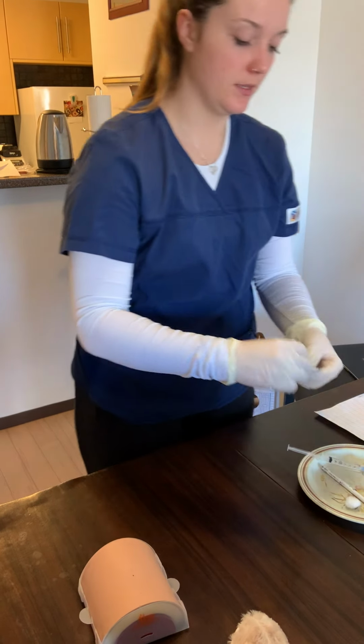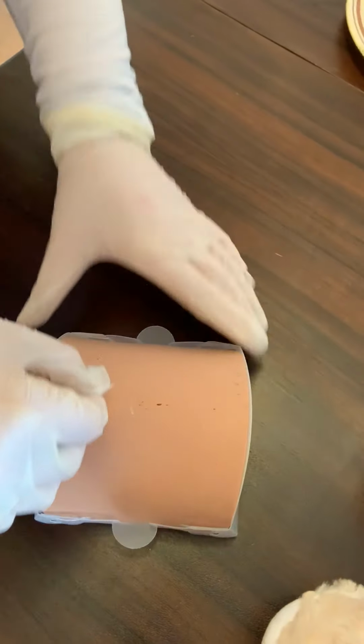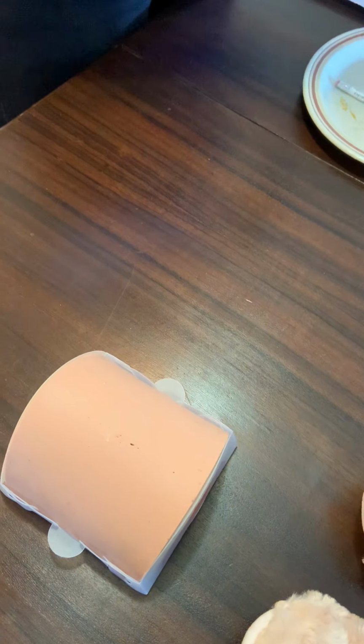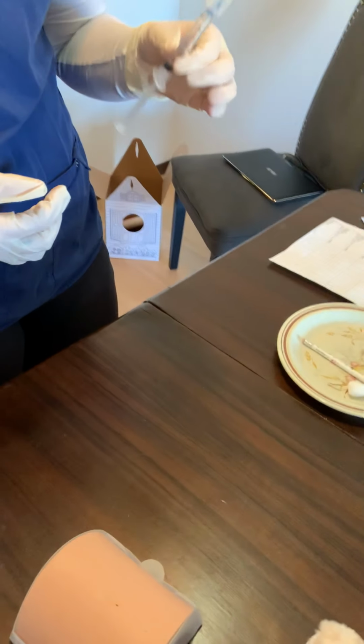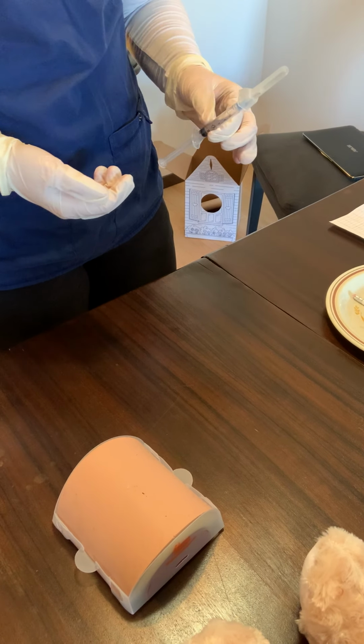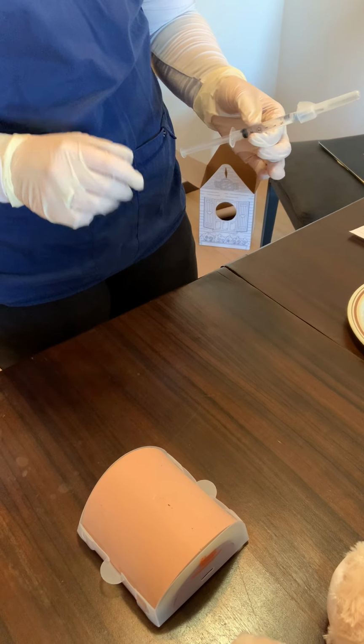I'm just going to clean the site in a circular motion for 30 seconds, and I'll let that dry. At my facility, they don't want us to aspirate, but if they did, I would inject the needle at a 90-degree angle, and then I would pull back on the plunger.